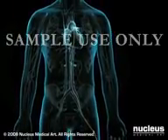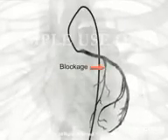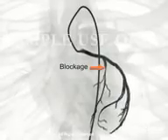arteries. To evaluate the coronary arteries, your doctor will remove the guide wire, position the tip of the catheter just inside the arteries, one at a time, and inject a special dye. This dye allows the fluoroscope to take X-ray images, called angiograms, of the artery's interior. Any blockages will be clearly identified as the arteries fill with dye.